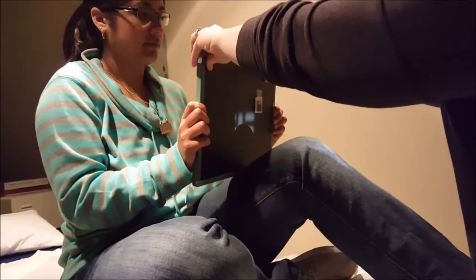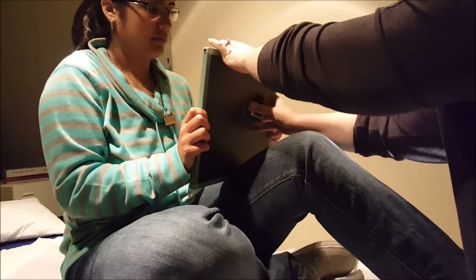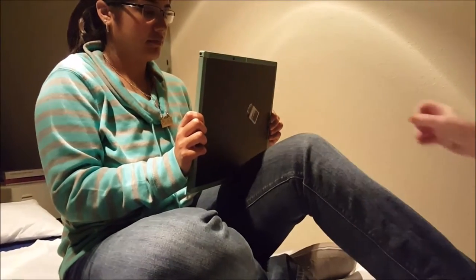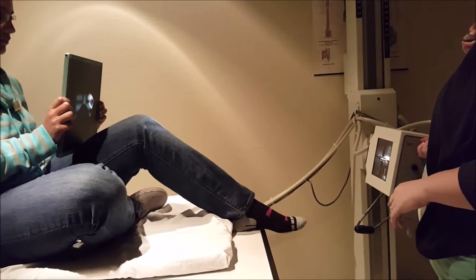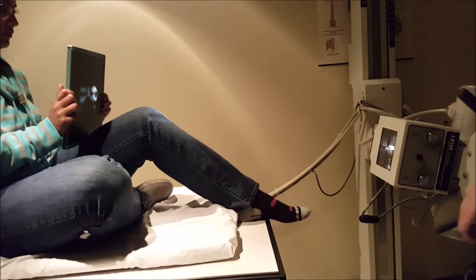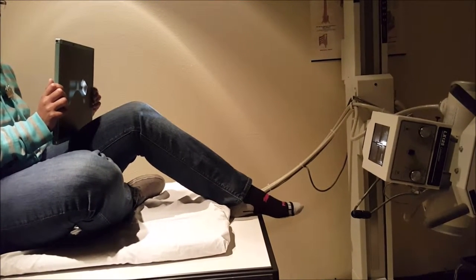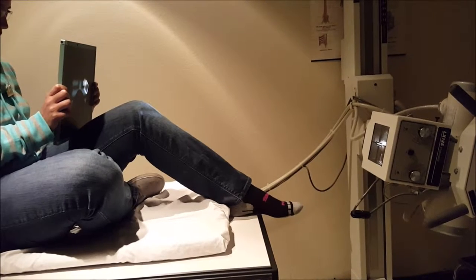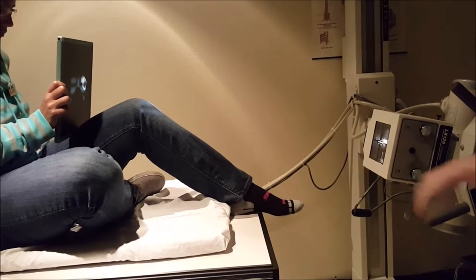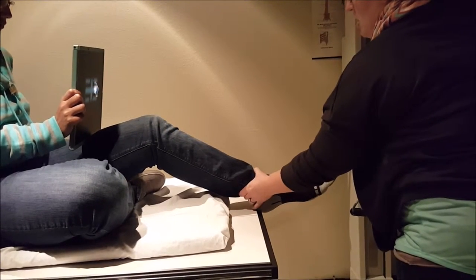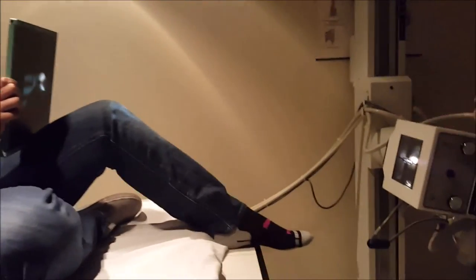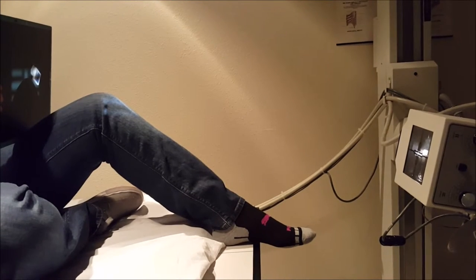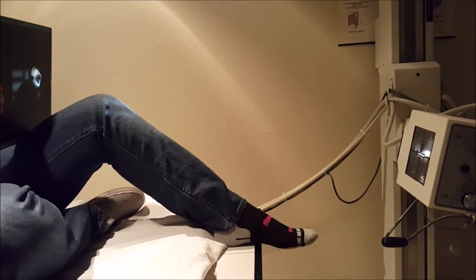And I still want to be centered to my cassette, so I'm going to move this down just a little bit. And move my marker so that it'll actually make it in. Well, that didn't make it in. And I like to just check, that's about 15 degrees or so from the leg. So obviously the amount of angle is going to vary, because if my patient's leg, all they can extend it is this much, my angle is going to be different than if they can extend it this much. So you don't want to have them overextend either because that will close the joint space. So this is a pretty fair approximation of what the sunrise would look like.